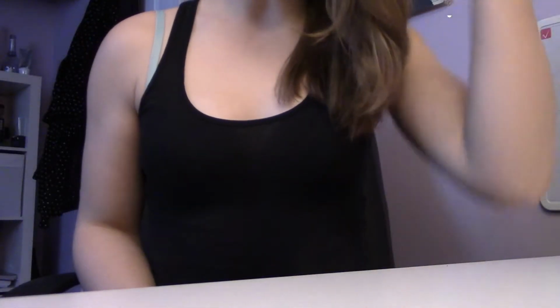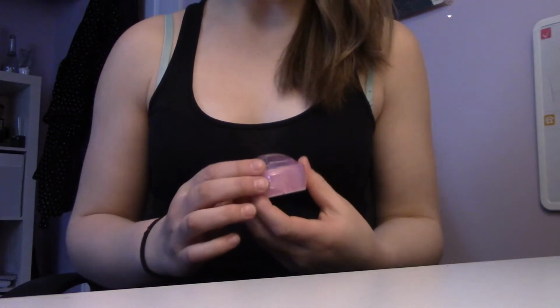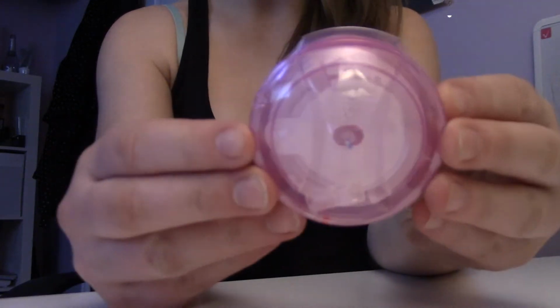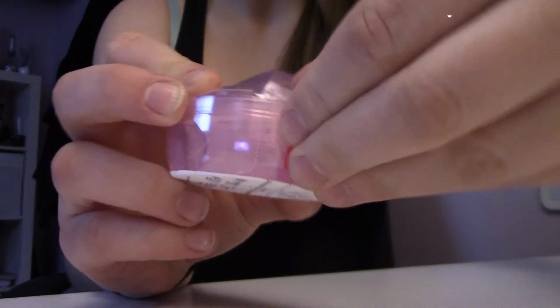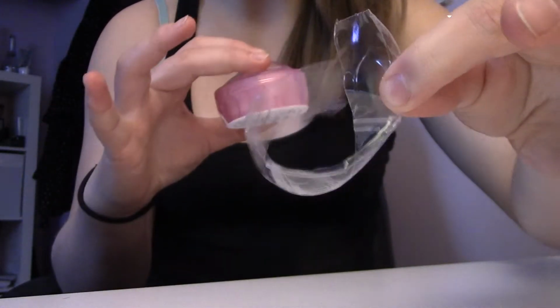Okay, so while your insulin pump is rewinding, you can go ahead and grab your insertion site, your new one. So that was the pink one like this. First thing I do is I take off this pink part here, just a little piece of plastic, and I just pull, and then take off the surrounding plastic like such.